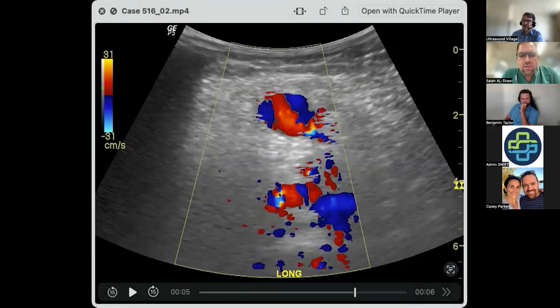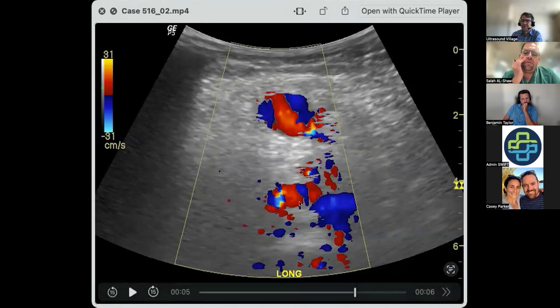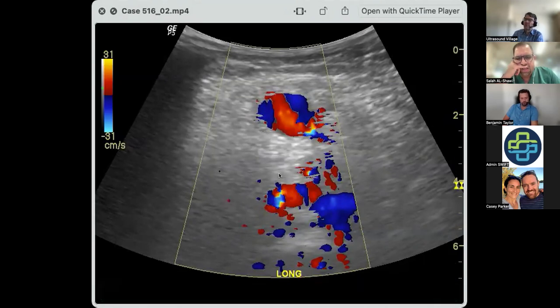You can see down here you've got this thing pulsating, and this thing doesn't pulsate. So that's the femoral artery and the femoral vein. And I told you he had an angioplasty or an angiogram a few days ago. So clinically, from the history, I would think of whether this is a pseudoaneurysm following the procedure. Okay, so what are the features of a pseudoaneurysm?